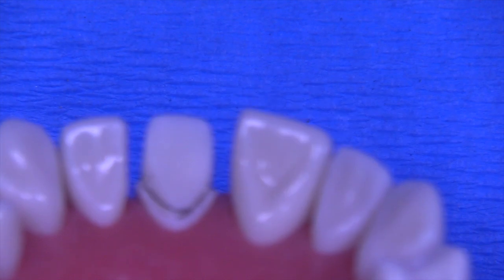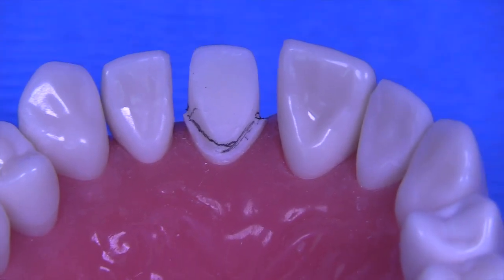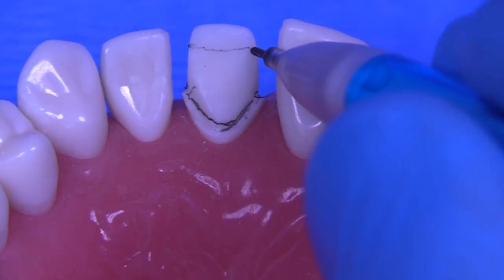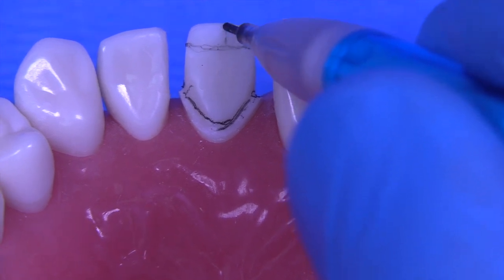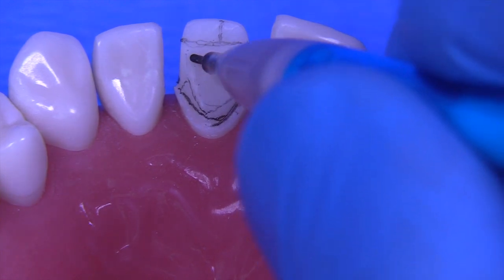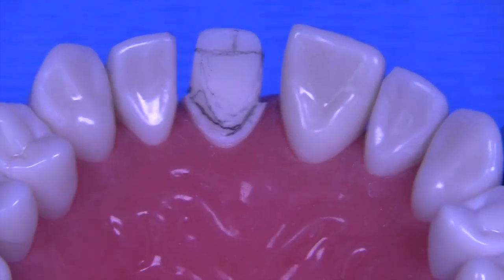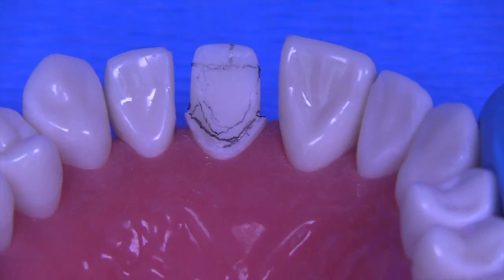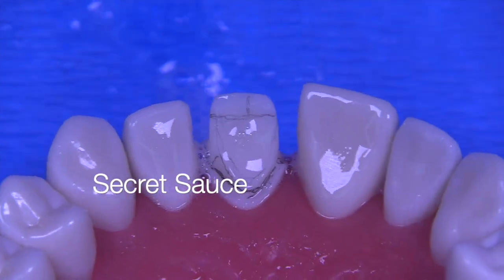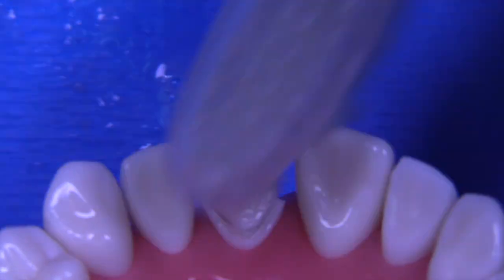And what we're looking for here on the lingual is a nice uniform parabolic shape that is parabolic from about a 2 millimeter line here. This is about 2 millimeters, and then this whole area in here should be uniformly slightly concave and parabolic in shape. And I think you did a very nice job with that particular aspect, so I'm not worried about that. Let's go ahead and use a little secret sauce here and clean up some of the pencil marks that I put on your tooth.